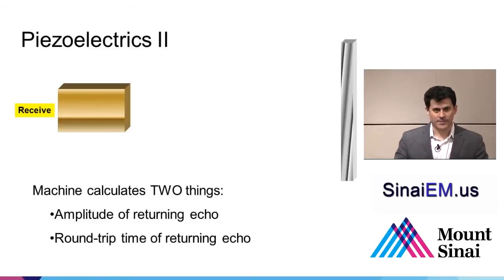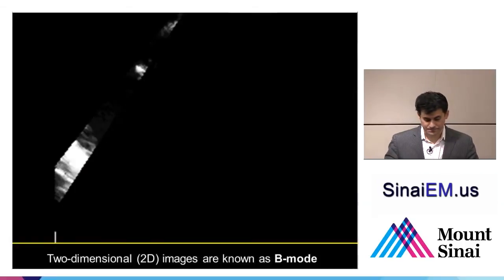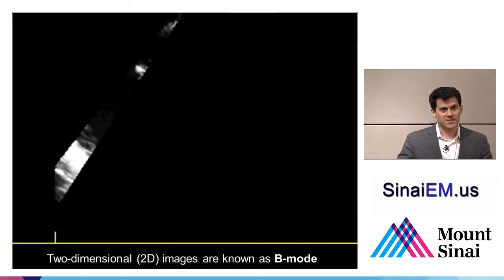And you can imagine that this would happen if you've seen those submarine movies, and you send out a ping, and then you listen, and you hear the clicks of returning echoes. And is that echo a ship? Is it a dolphin? Is it a rock formation? It really depends on the movie, but in our case, it's going to be different based on which structure it's hitting. So we send out a signal.